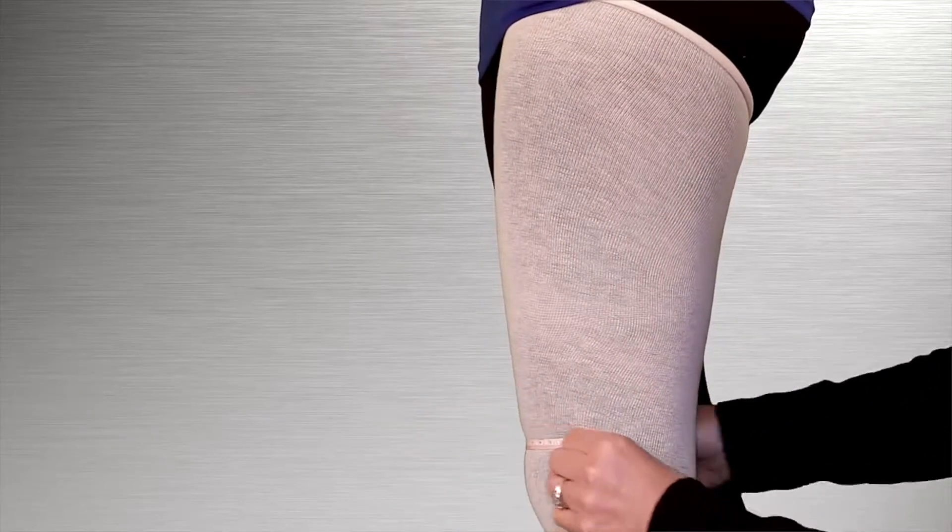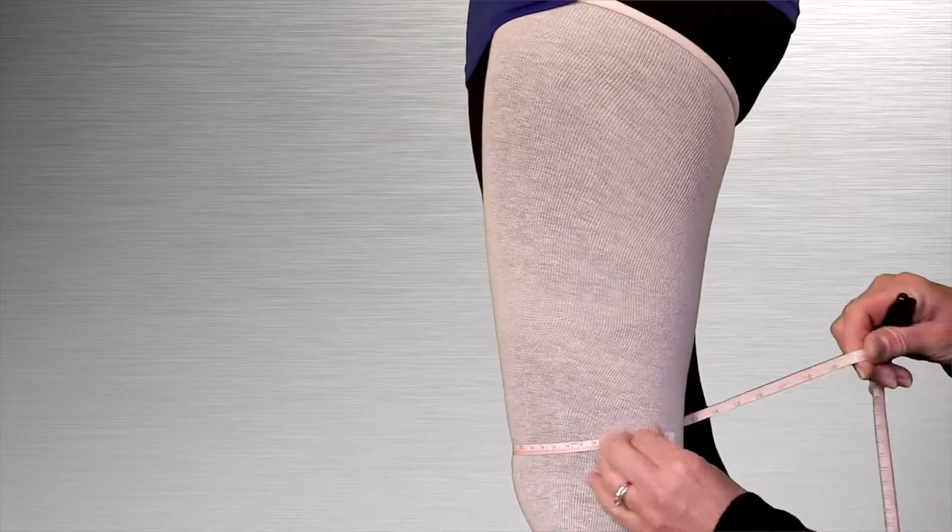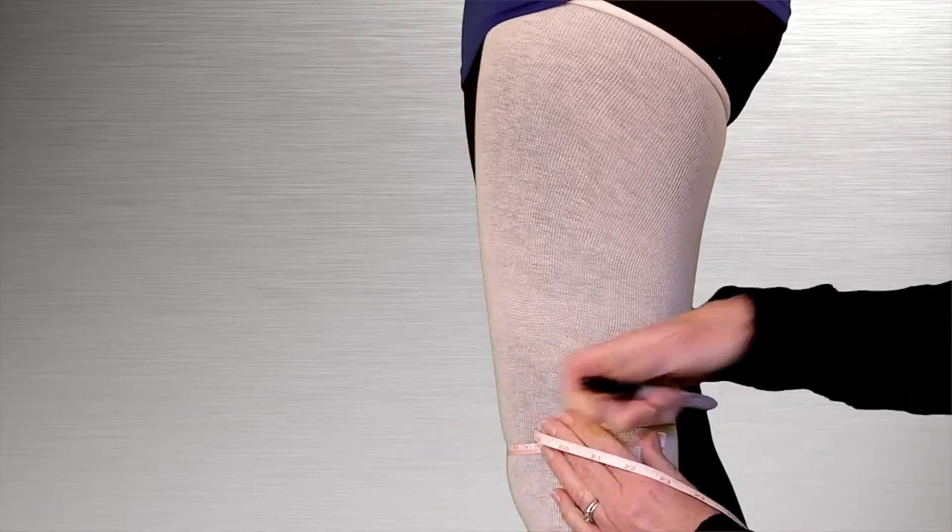With the patient standing, encircle the leg at the top of the patella and mark the lateral aspect of the leg.